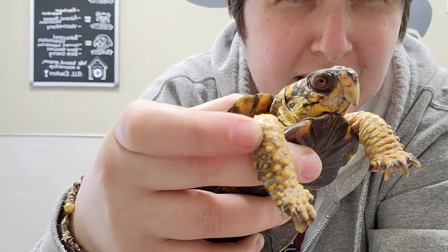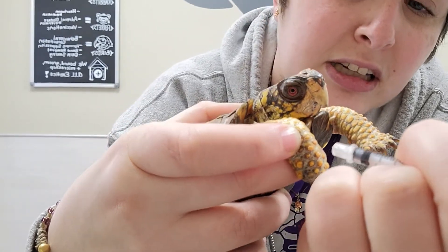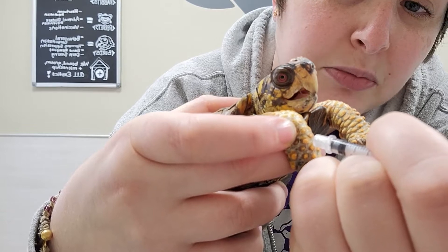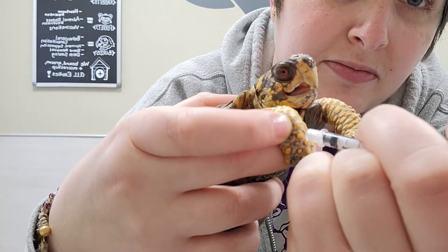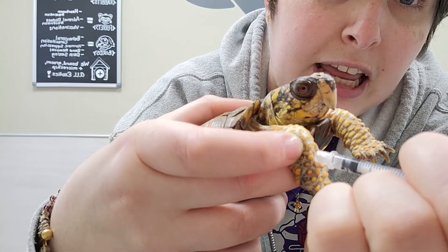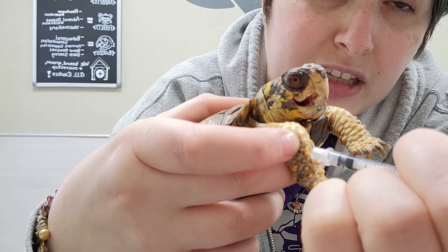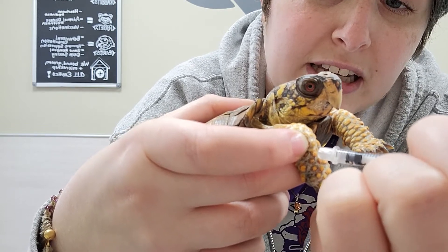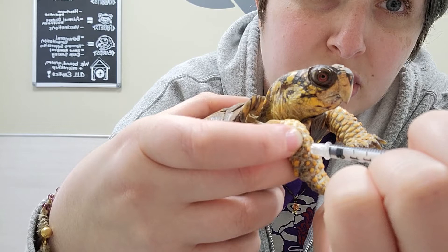So we've got our leg here, I'm holding it, and I'm going to go between the scales and put the needle in. I'll pull the syringe back and make sure I'm getting negative pressure — once I get negative pressure and no blood, I'll go ahead and push the injection in.